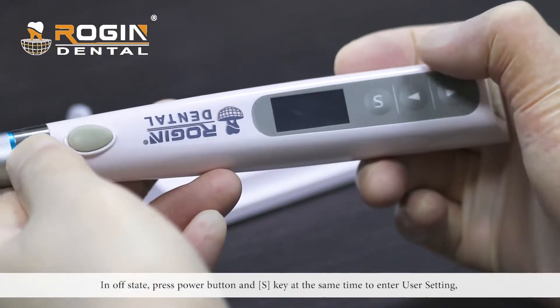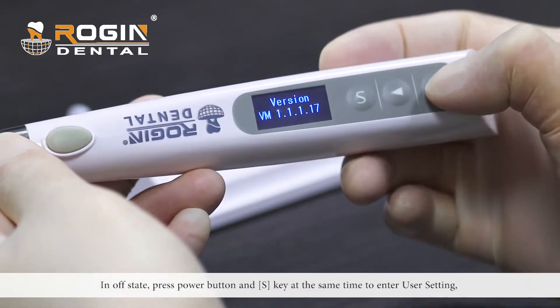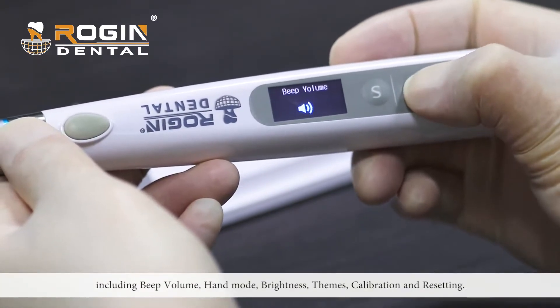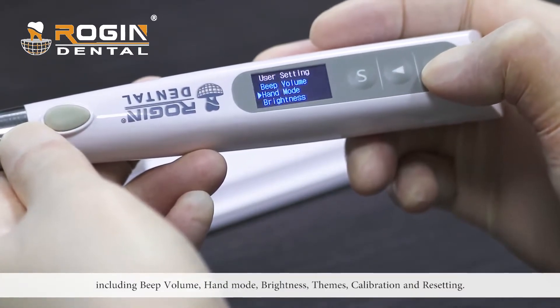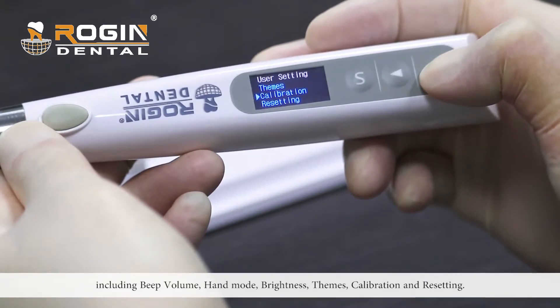In the OFF state, press the power button and S button at the same time to enter user settings. Options include themes, calibration, and resetting.